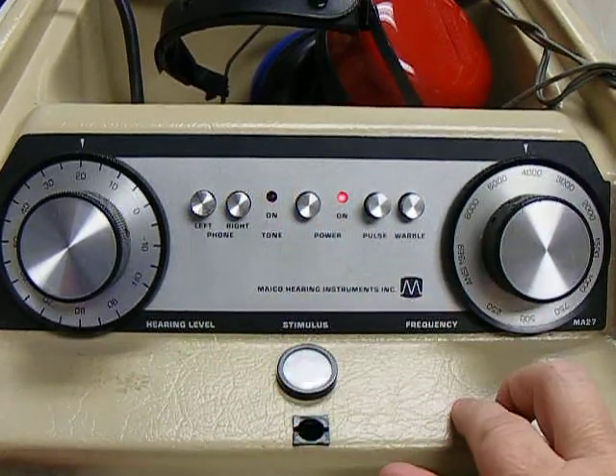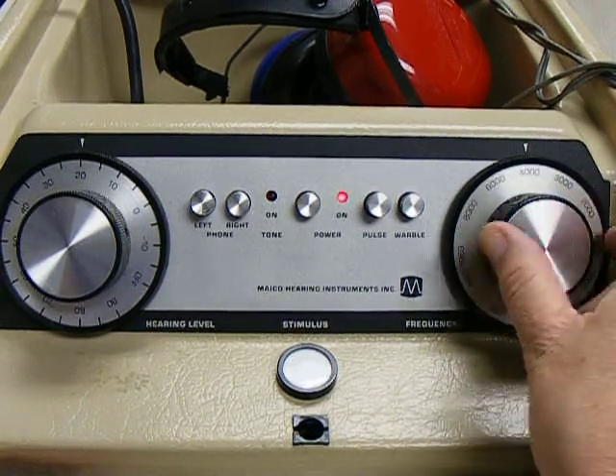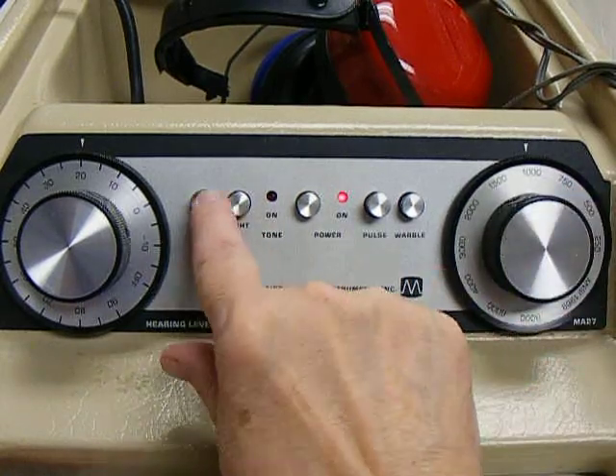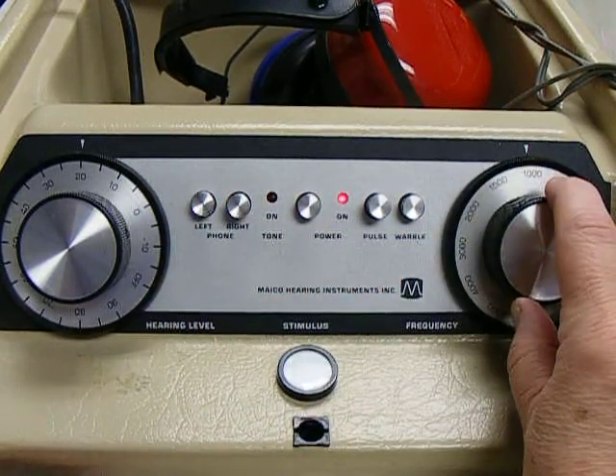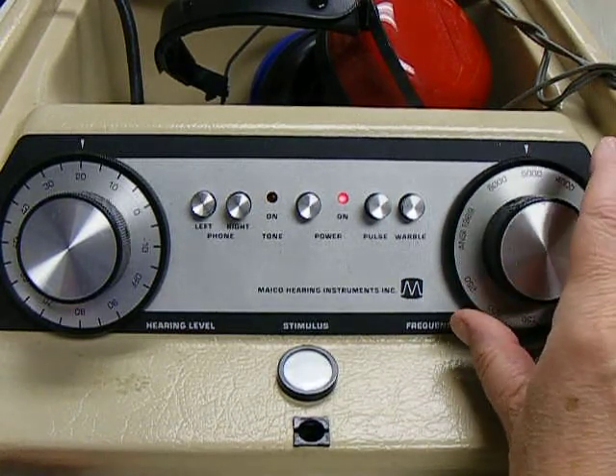For a middle school or a high school student, you would present at 6,000, 4,000, 2,000, 1,000, then switch to the left ear and present 1,000, 2,000, 4,000, 6,000.